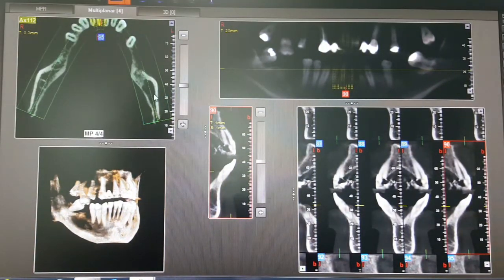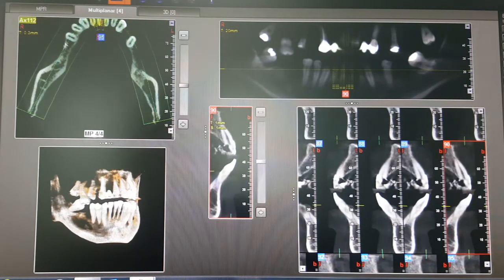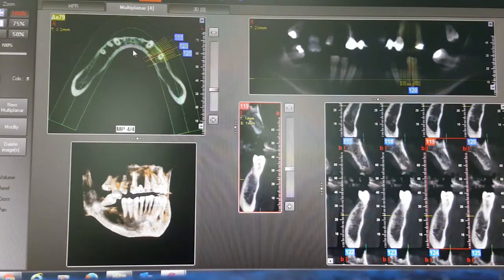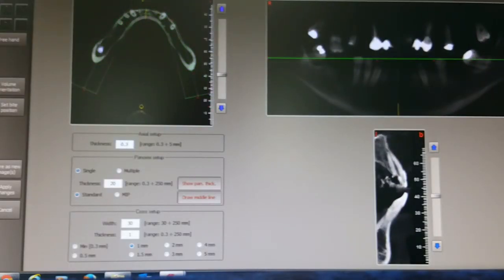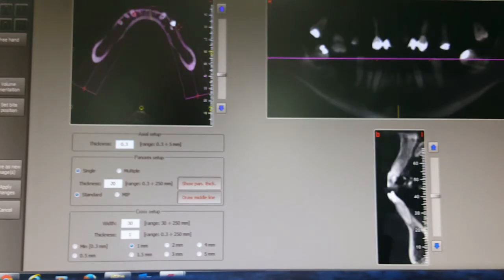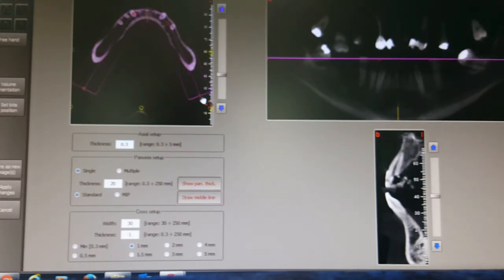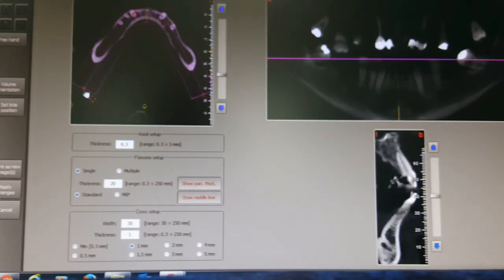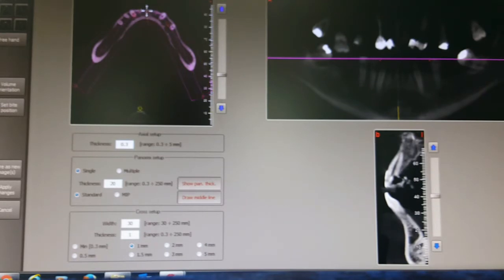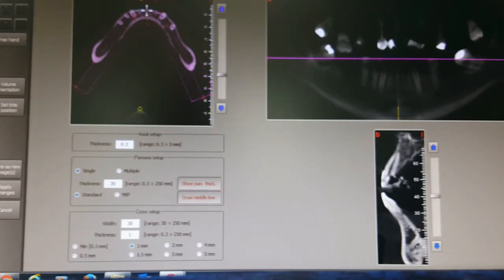Once you double-click and come out, you get the exact panoramic view size that you asked for when you double-clicked in the axial view. Now that this is ready, you can also make final changes by slightly modifying it. Here you can see the center line is not exactly on the center of the mandible, so you can slightly pull it towards the center. Get this line in the center, and this line as well running through the center.